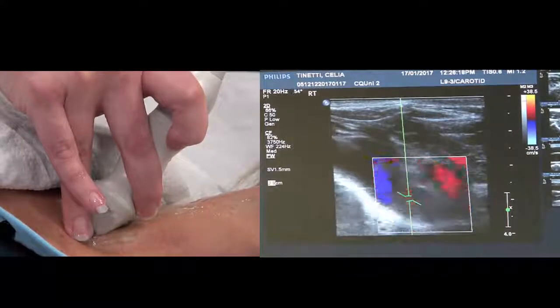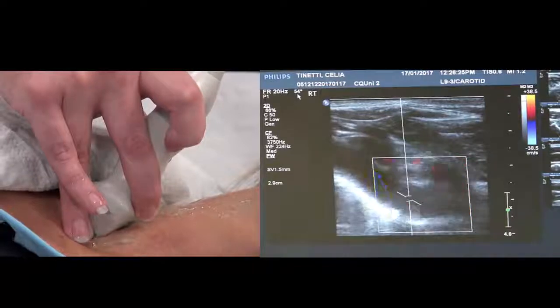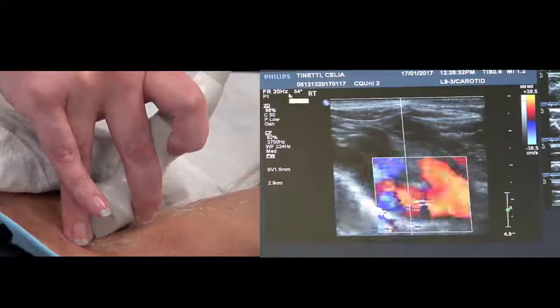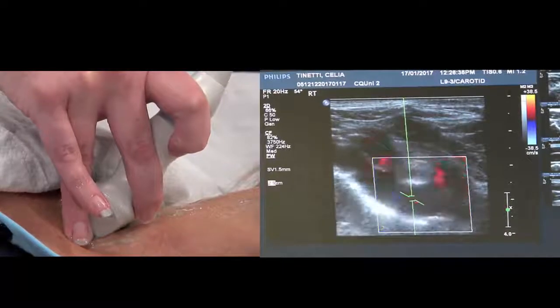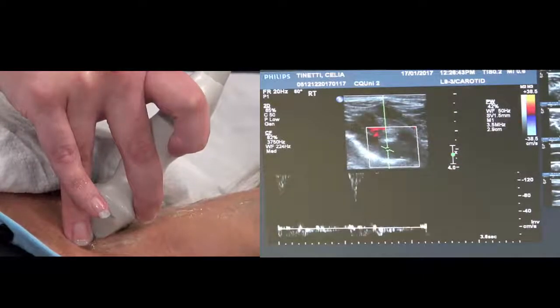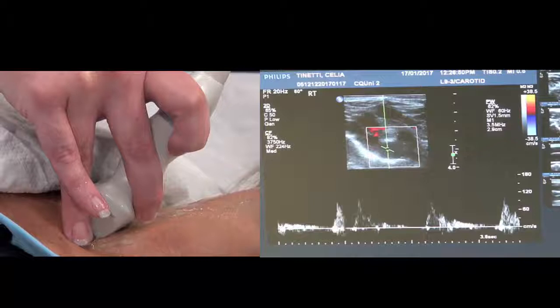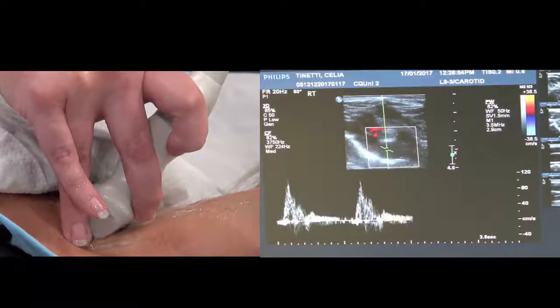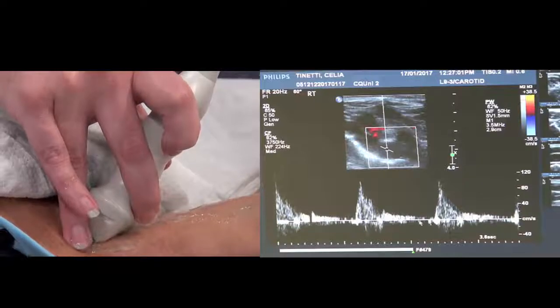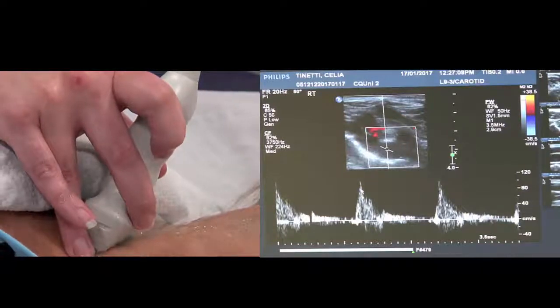This angle up here says 54. I don't mind what it is as long as it's as accurate as you can get and less than or equal to 60. I'm going to put it about here — needs to go a little bit flatter. That's at 60 now. So update and do a trace, optimize your image. Remember you want it about over half, sort of three quarters of the screen. You want the baseline up a little bit so it's got room there. This is an acceptable image — it just needs to show that there's flow coming through it.